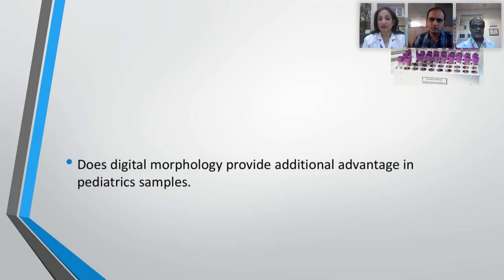Right. Thank you for sharing. I would like to add on this regarding the pediatric sample. One thing which I noticed when we had our pediatric samples, the automated slide maker stainers usually give you that monolayer to see. So it is the same challenge as it is under a microscope. It is the similar challenge you will face in the digital.